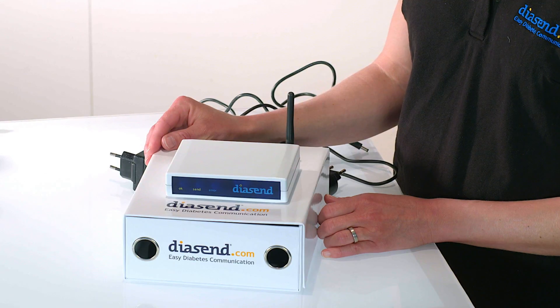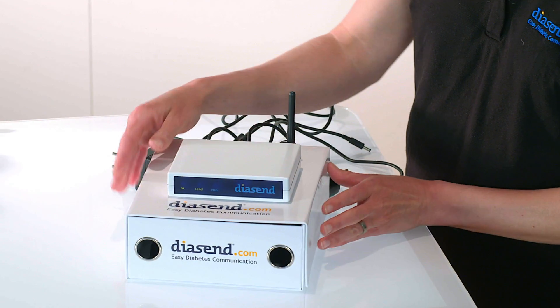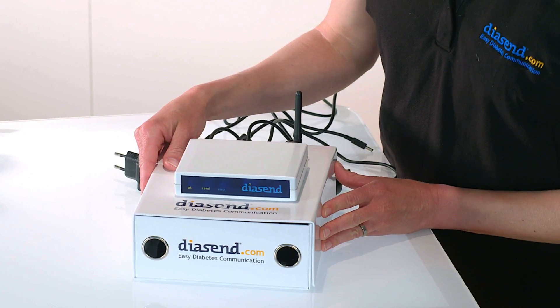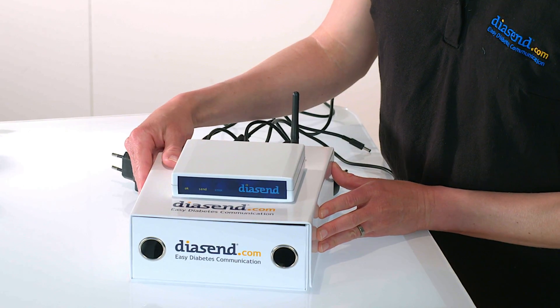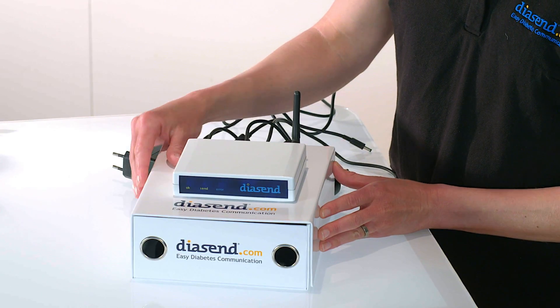Hi, welcome to diasend. My name is Christy. In this video we will show you how to set up the diasend transmitter in a clinic. The diasend transmitter box uploads information via cellular network, the same as your mobile phone. This means that you do not have to be connected to the internet or in fact near a computer for the box to upload data.